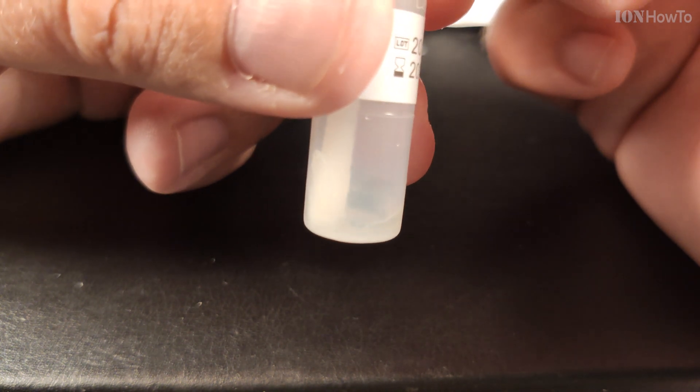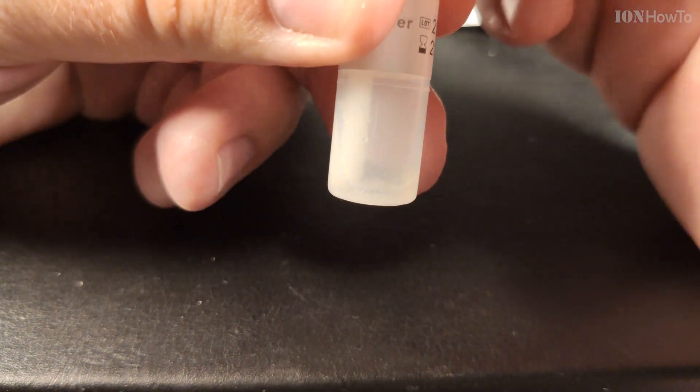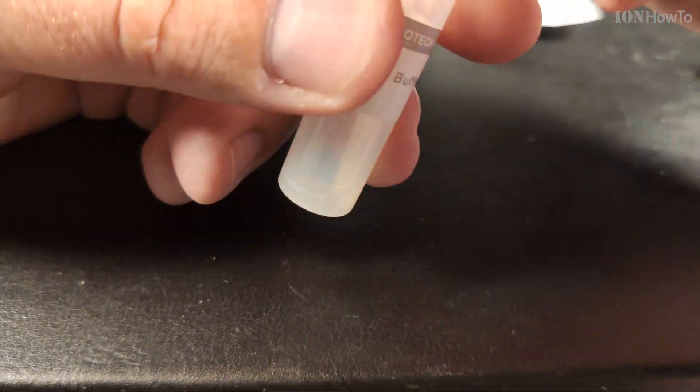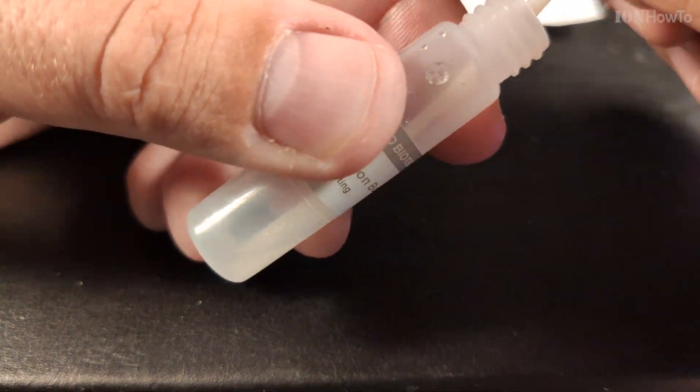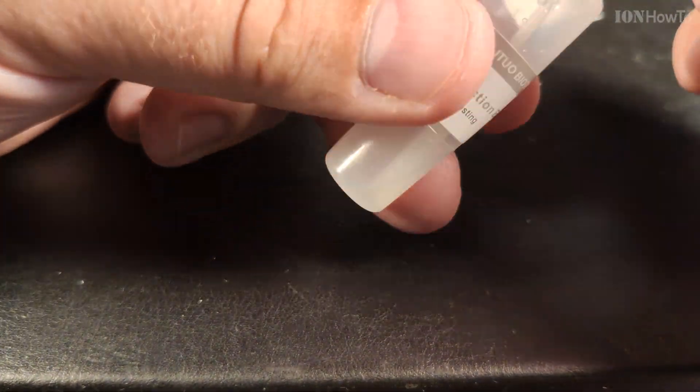This is not medical advice. You should follow the instructions provided with your self-test or the instructions from your medical provider, from your doctor.